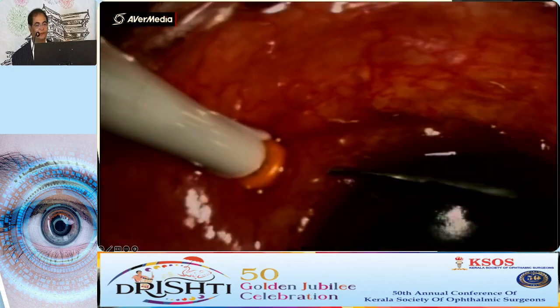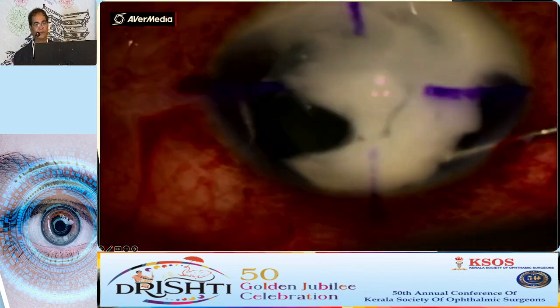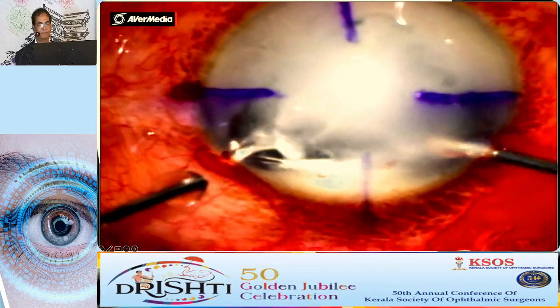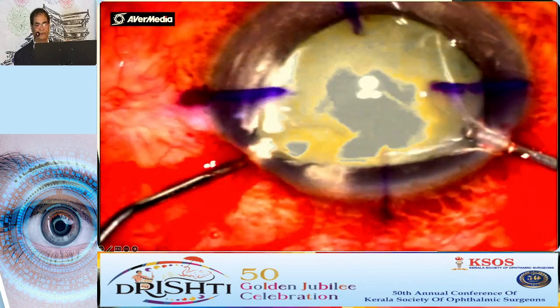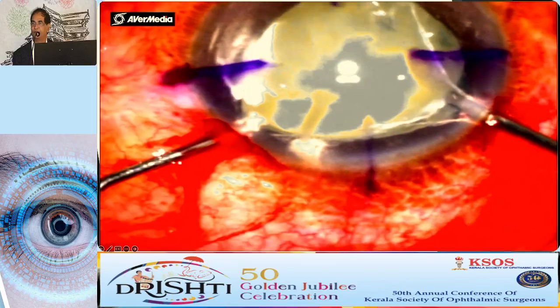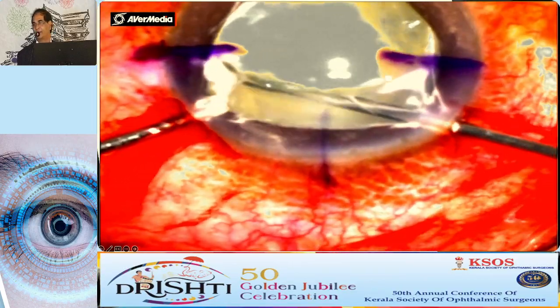For that, I have used a trocar with irrigation fluid. If you put that, the fluid will push the lens up. Now it has come into the patellar fossa. Now you do the vitrectomy. The vitrectomy has to be thorough up to the mid vitreous cavity. Again, as I told you, some vitreous fiber will definitely come in the side ports. Now I am going behind the lens and doing the vitrectomy.